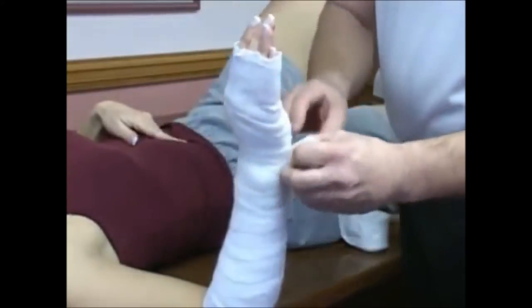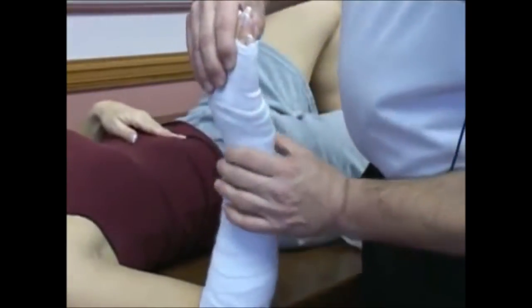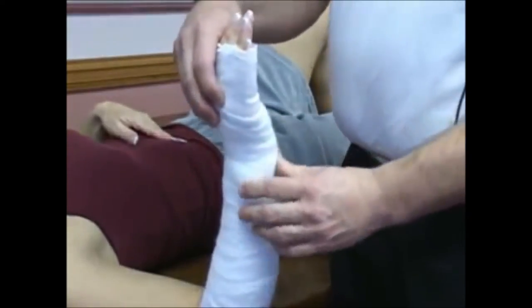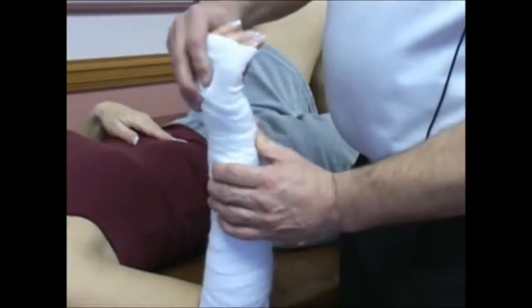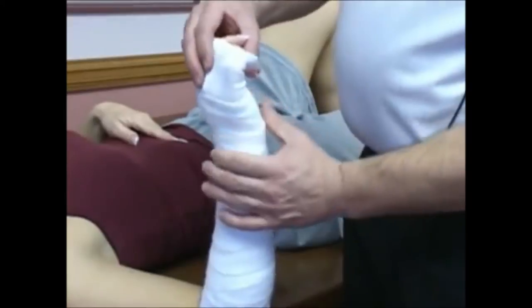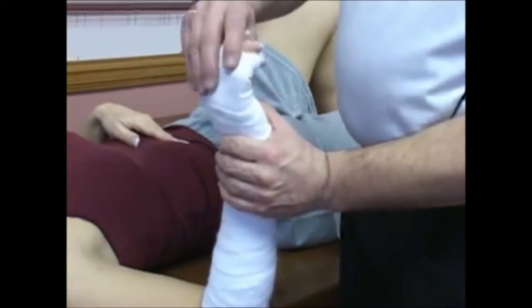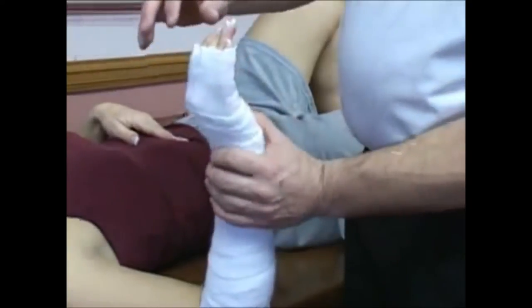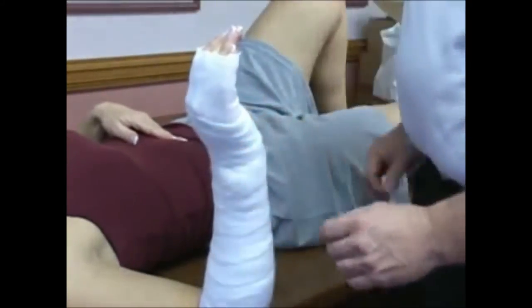I'm going to straighten the wrist out just a little bit here. There are several positions for the short arm cast depending on the nature of the injury — flexion, extension, and neutral. Neutral is where you'll be able to grasp and hold on to things. This is neutral position — your thumb is kind of lined up with the radius.